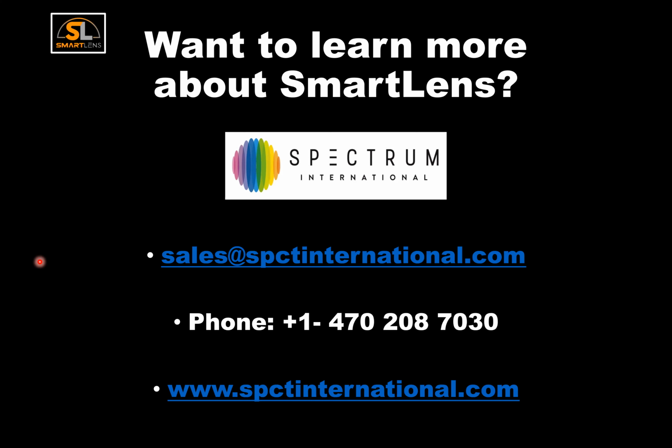So with the systems that we have available, at least in North America, my apologies, I'm not so familiar with all the fluids that you have accessible to you in the Middle East. We've been really happy with the peroxide systems. Yes, just remember that once these lenses come with HydraPEG, HydraPEG can be affected by peroxide. So just be careful and please ask questions before you use peroxide with HydraPEG. And please just refer all your questions to our consultants.